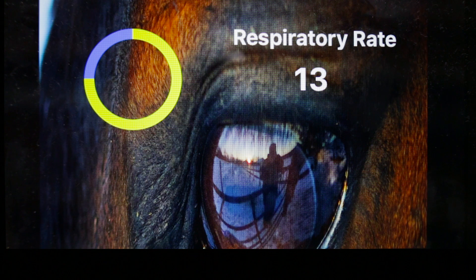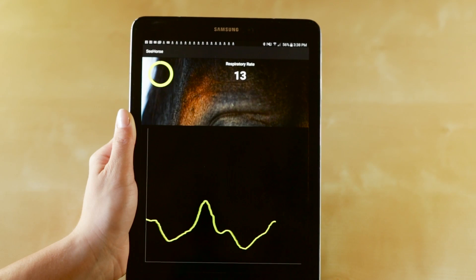You'll also see a number displayed under respiration rate, which represents the number of breaths your horse is taking per minute. At the bottom of the screen, you'll see a graph which shows you your horse's lung movement in real time.